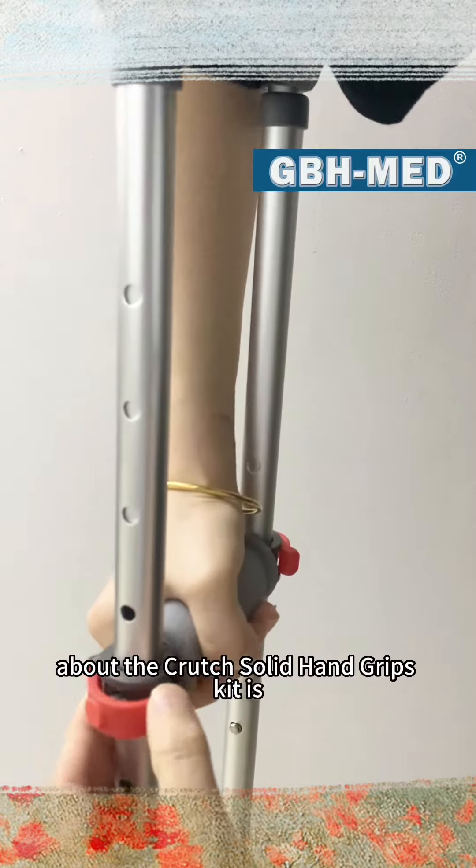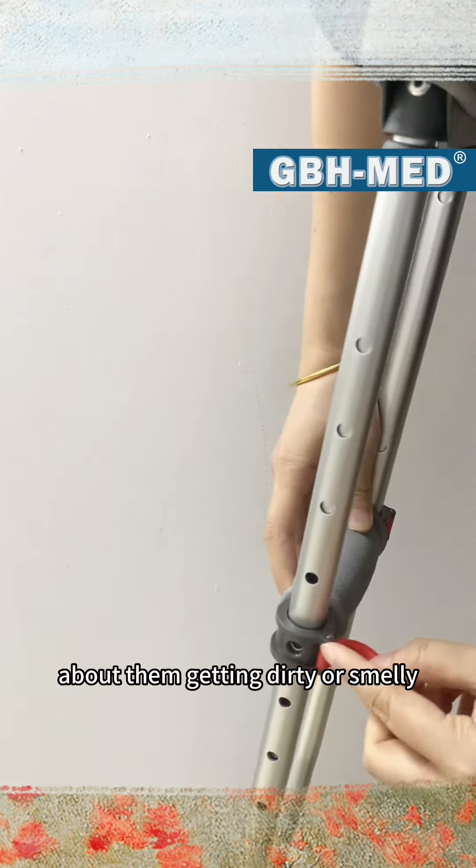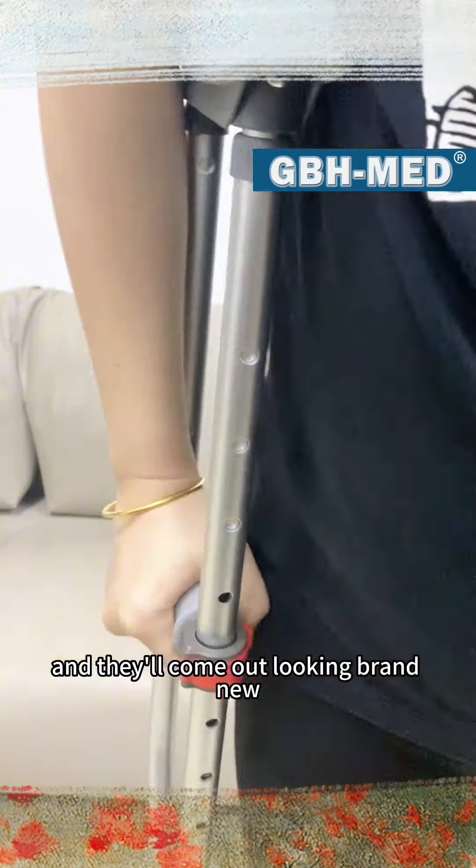One of the best things about the Crutch Solid Hand Grips Kit is that they're washable. You don't have to worry about them getting dirty or smelly, because you can simply toss them in the washing machine and they'll come out looking brand new.